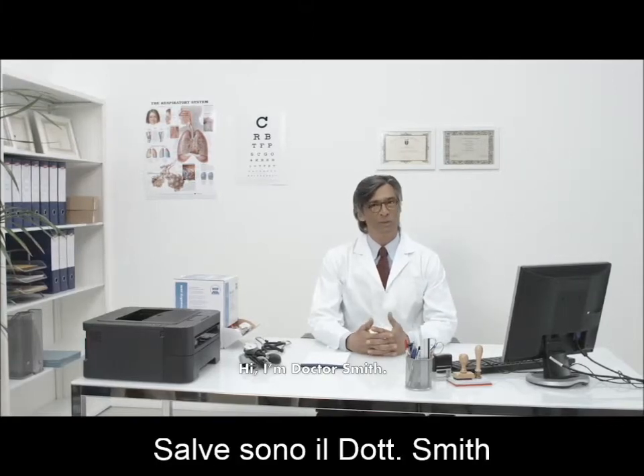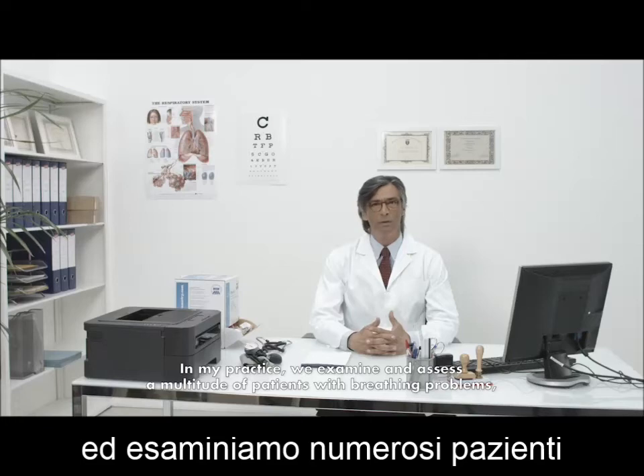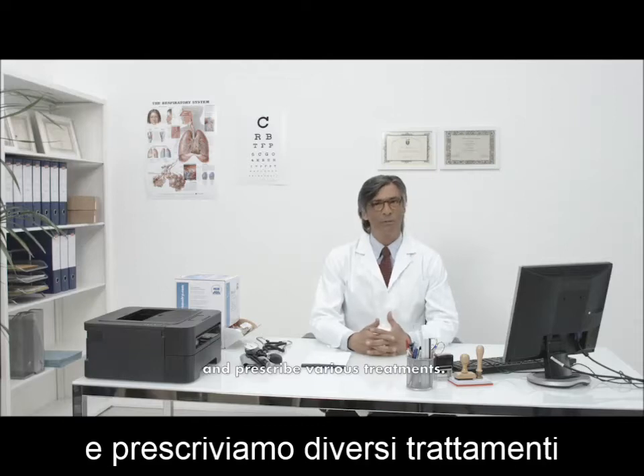Hi, I'm Dr. Smith. In my practice, we examine and assess a multitude of patients with breathing problems, such as asthma and COPD, and we prescribe various treatments.